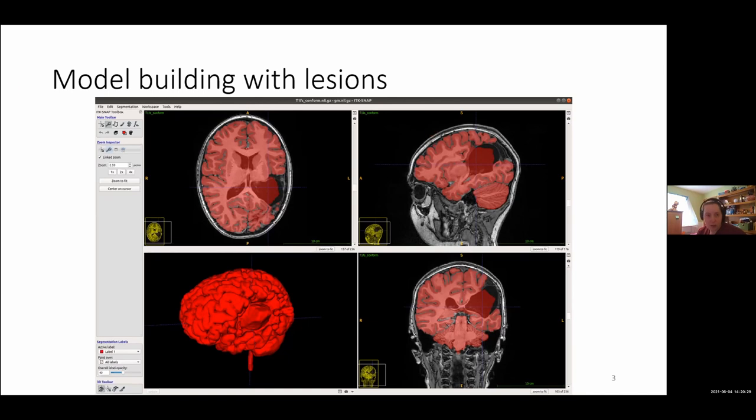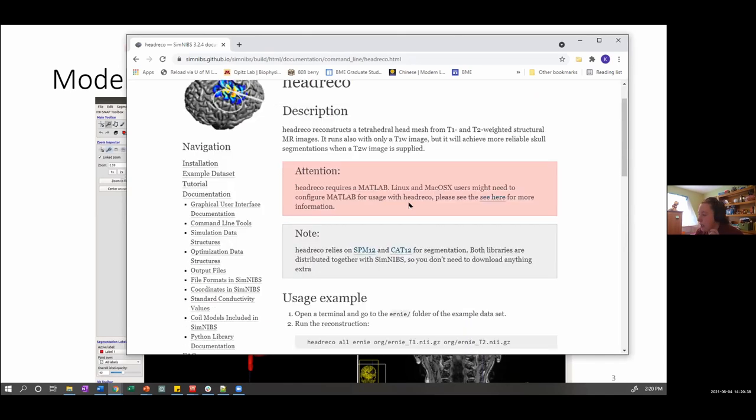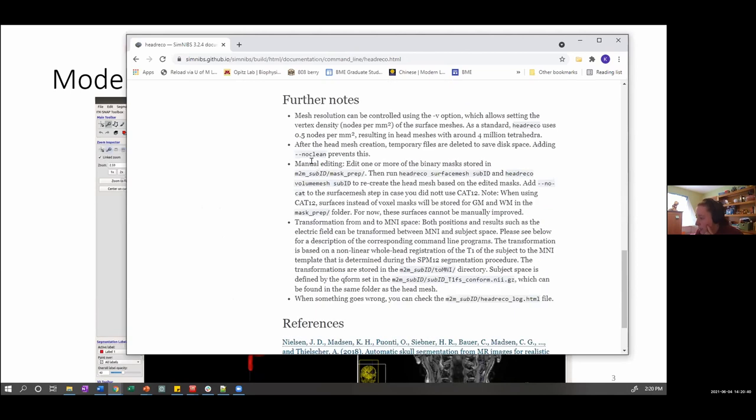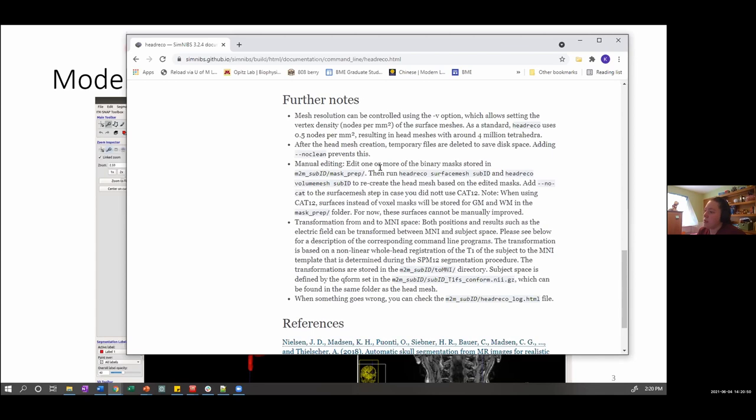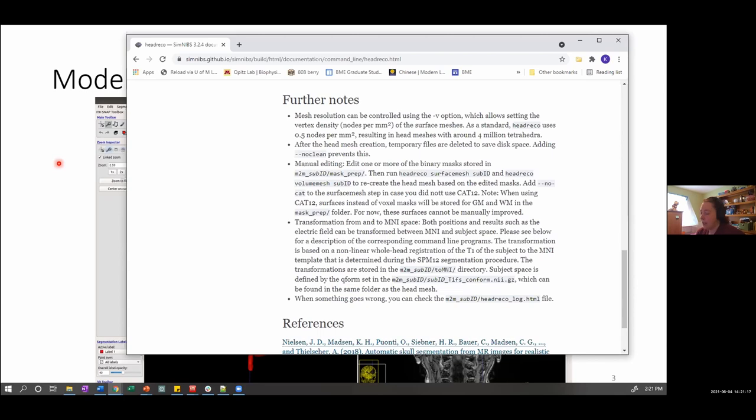When I ran this MRI through HEDRICO, this was the result. And clearly, this part should not be considered gray matter. And so that's why we need to do hand edits. At this point, HEDRICO does allow you to do manual editing. So you can run your MRIs through HEDRICO, and then you can edit your masks by hand, and then you can rerun HEDRICO from a later point using surface mesh and volume mesh to recreate the mesh. If you can get away with using this, I would highly recommend it.